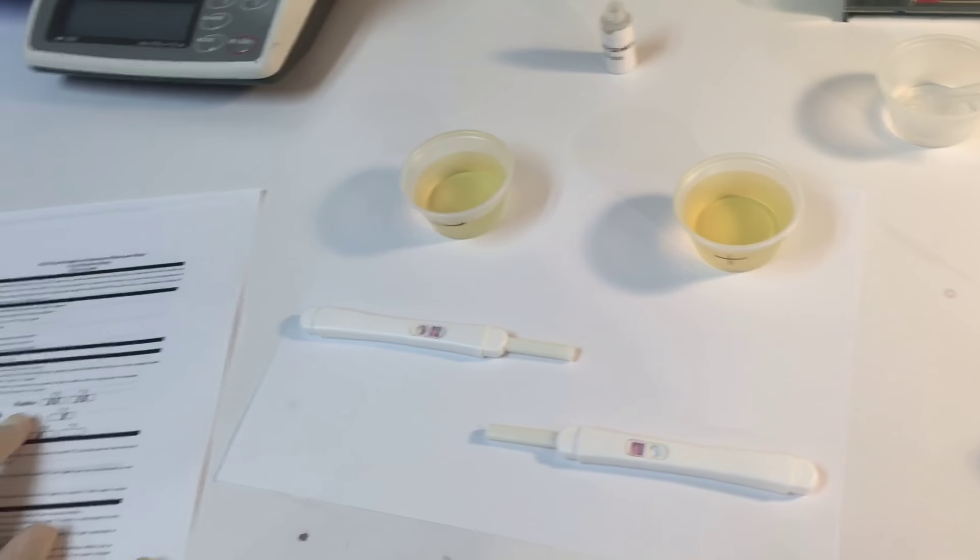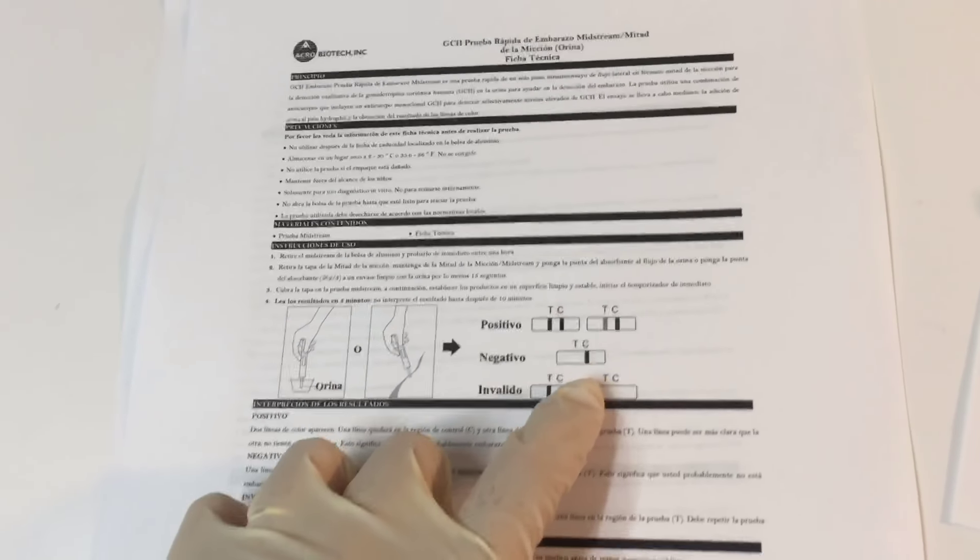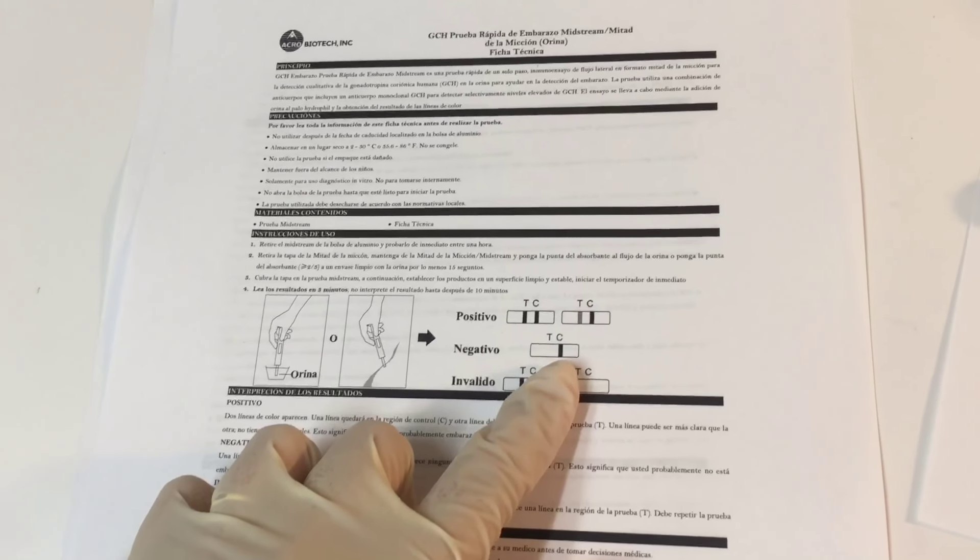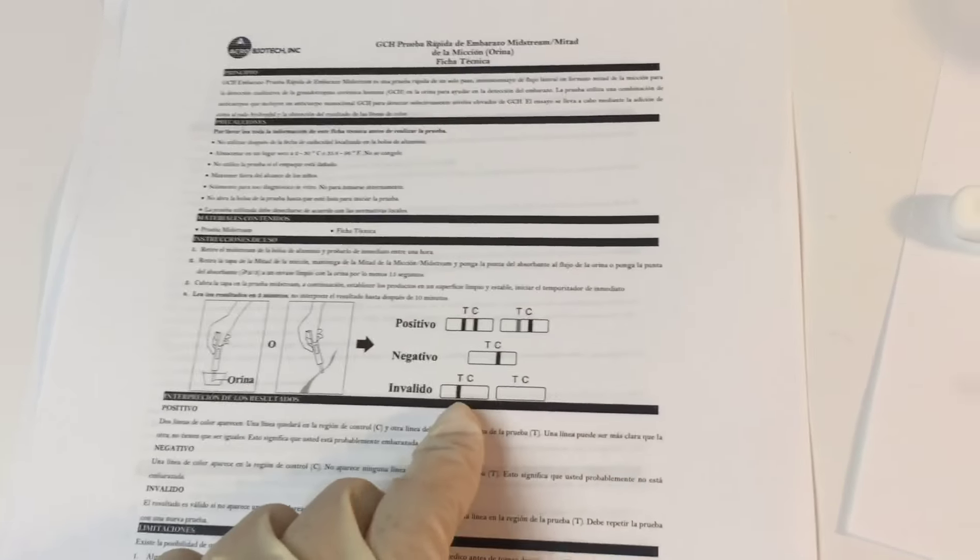So as we can see, if we have two lines, that means it's positive. If we only have one, the control line, that means it's negative. The control line is very important because it's the one that shows that the test is well done, or if it's not there, that we didn't do it well.